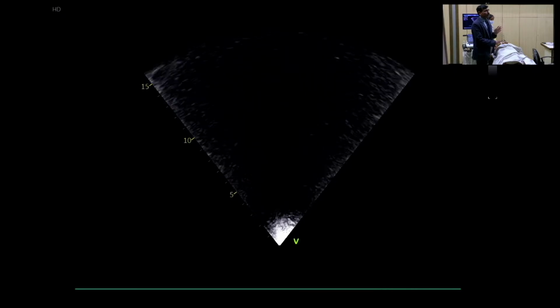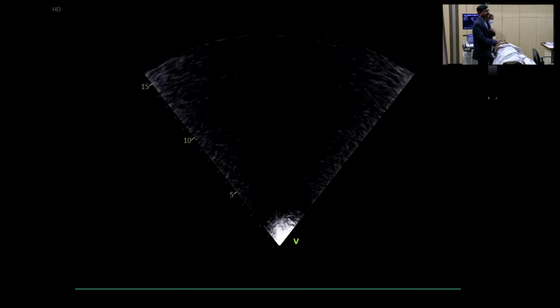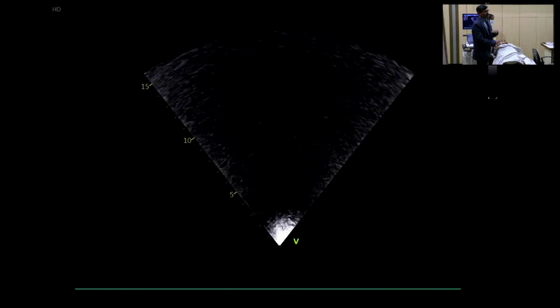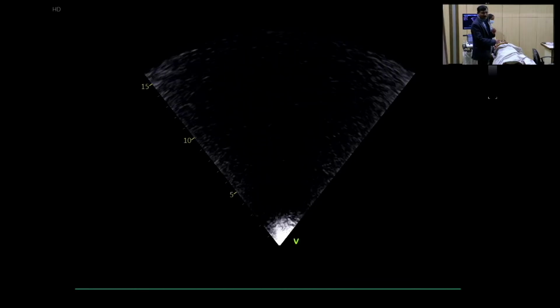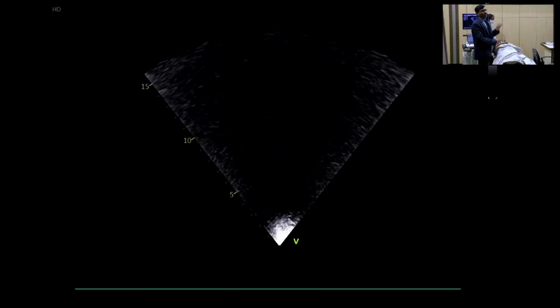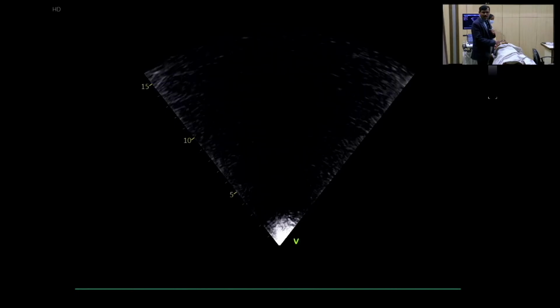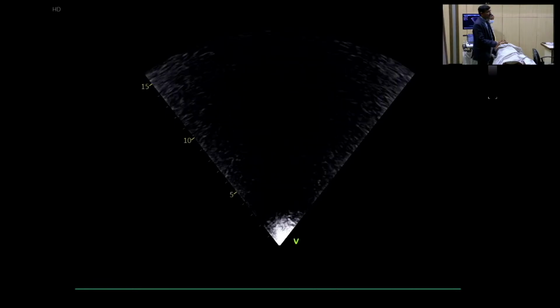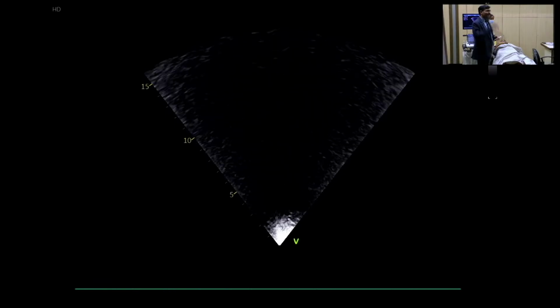Unroofing, forget about the coronary sinus. Azygos vein, no. Coronary sinus, no. Azygos vein is too far from the coronary sinus. Fistula, no. Coronary sinus fistula. AP window, no. Yes. But ये ले.